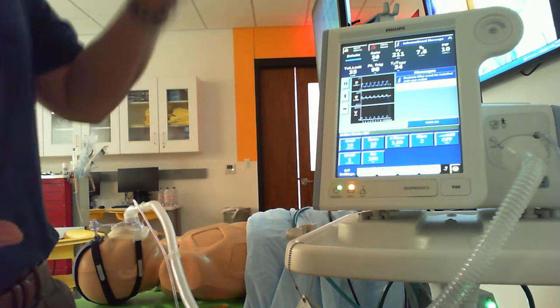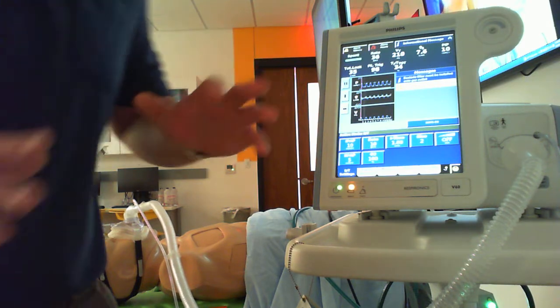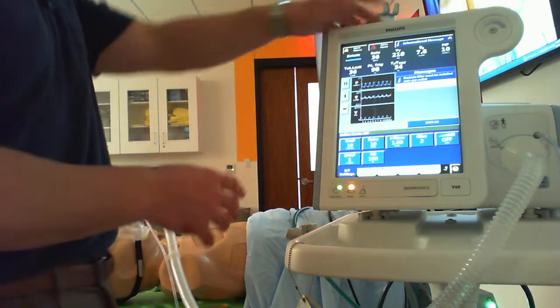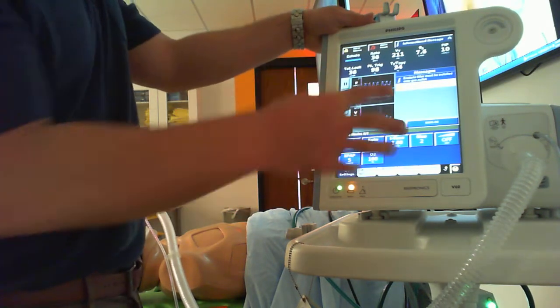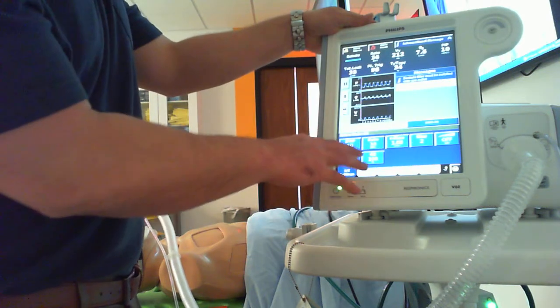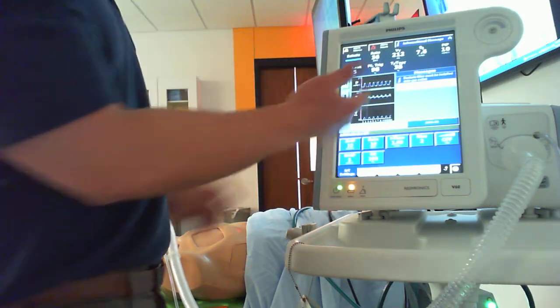I'd consider going up on an increased baseline, making sure it's not a tension pneumothorax or something causing problems. That'd be an absolute contraindication of this type of therapy. So right now, if my saturations are okay, I can look at trying to wean that down, okay? Right now I'm giving 5 centimeters of pressure support. And what are our goals?